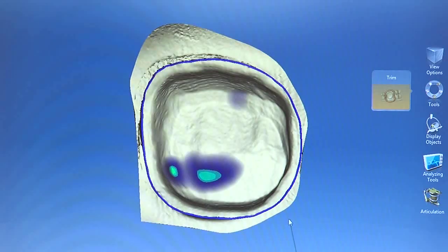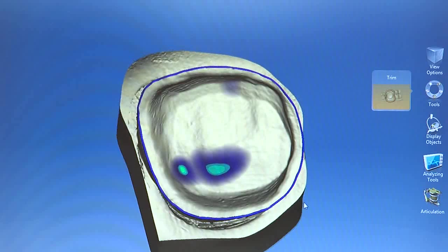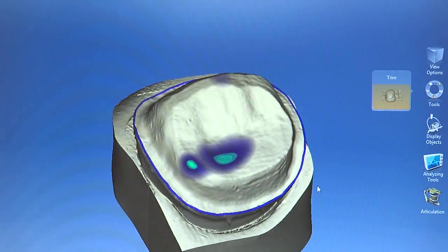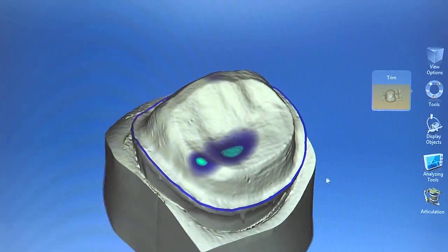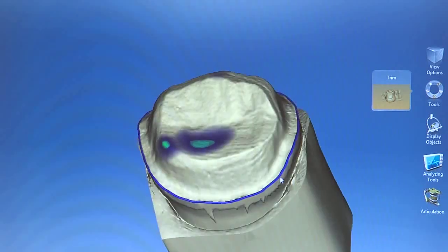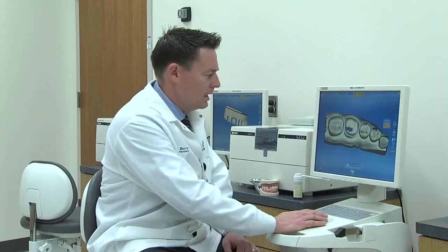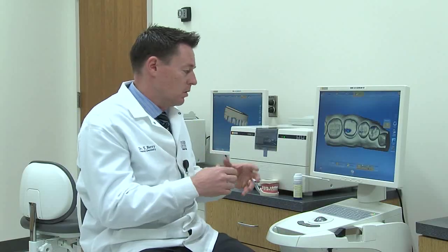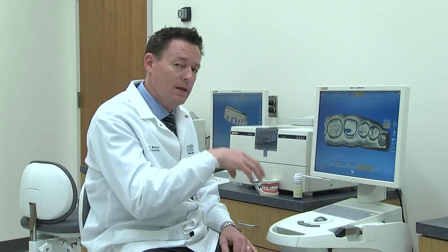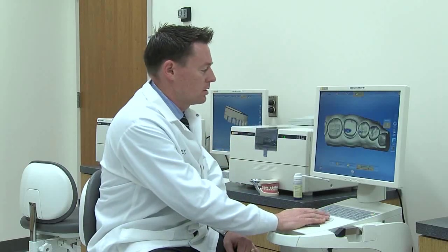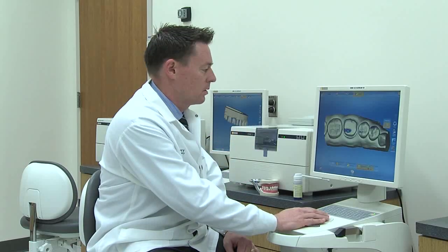Now in this phase, we have to tell the computer exactly where that crown margin will be — where that tooth and crown will meet. And now we're going to define the insertion axis of the crown, or how that restoration inserts onto the tooth.